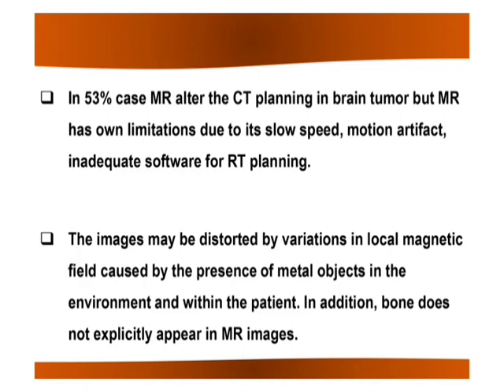So far as the PET scan is concerned, the positron emission tomography images do not provide the resolution of CT or MRI images, but they do provide the physiological and biochemical information that may be important for localizing certain disease and determining the response of radiotherapy by their hot spots and cold spots. PET CT fusion images are very helpful in treatment planning and follow-up.